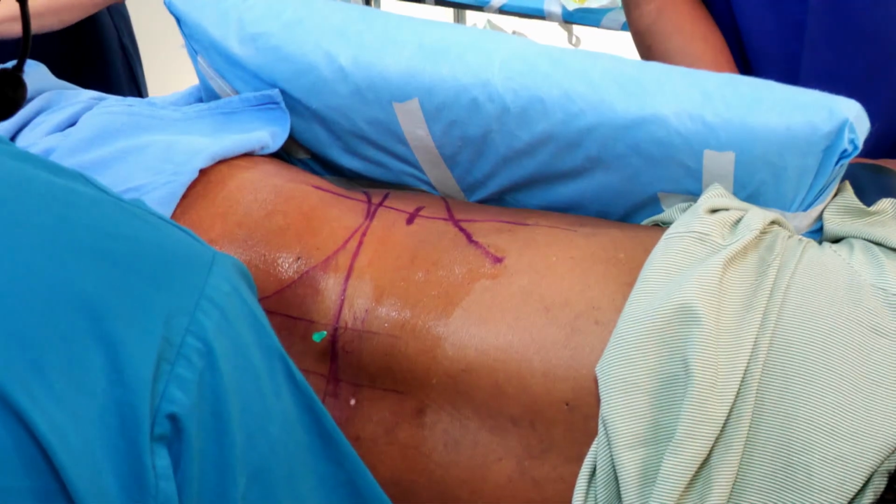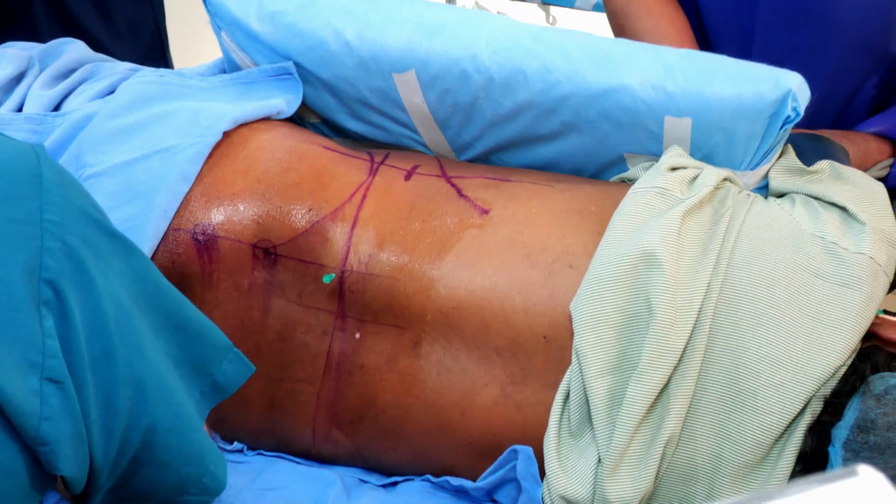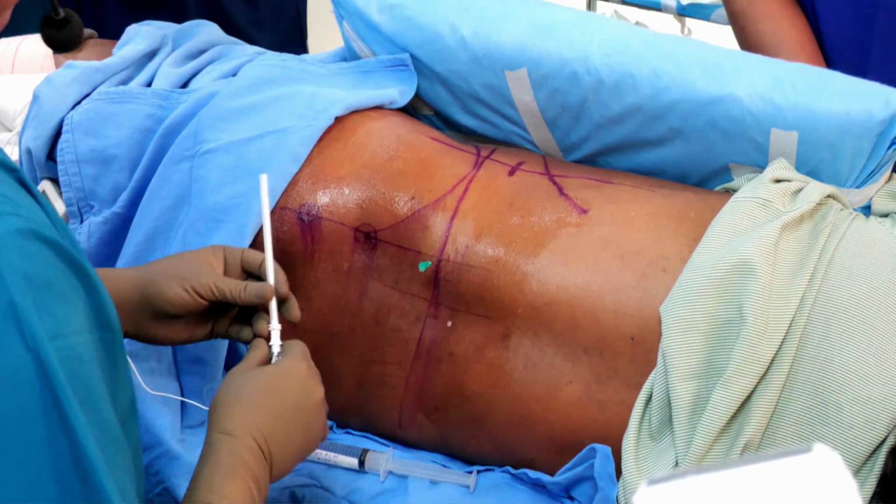So we're just connecting the peripheral nerve stimulator. Initially we'll go with the landmark technique, and if we don't get the contractions, then we go ahead with the ultrasound.